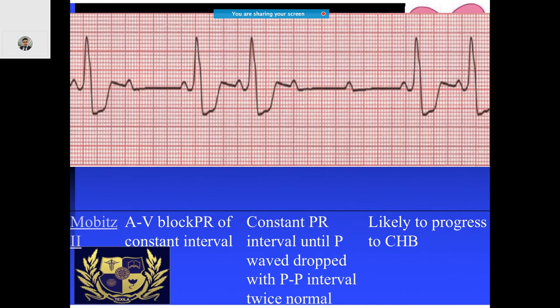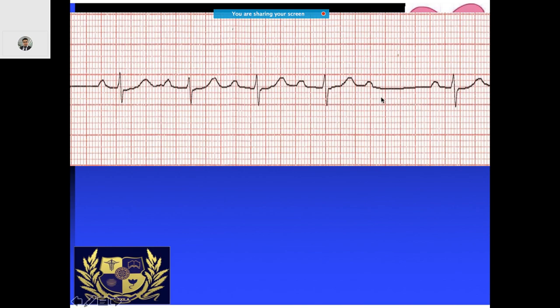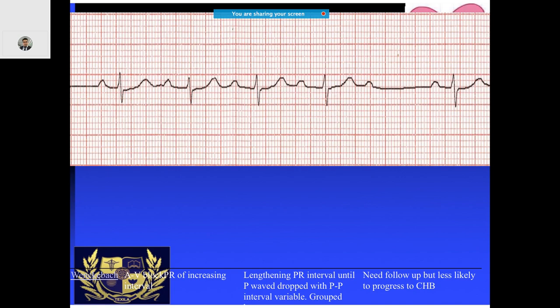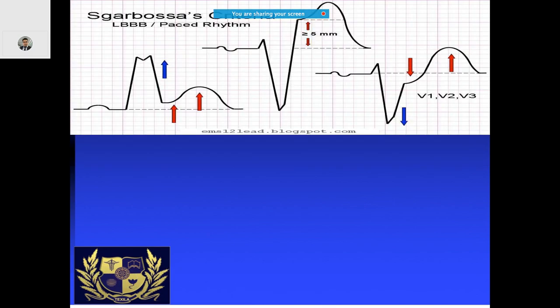This ECG shows Mobitz 2 block — the PP intervals are all fixed, the RR intervals are also fixed, but whenever there is a missed beat, those intervals are almost twice the normal RR interval. In another ECG, the PR interval is progressively prolonged with a missed beat — this is characteristic of Wenckebach phenomenon. These patients are less likely to progress to complete heart block.